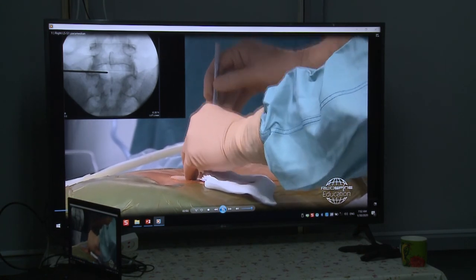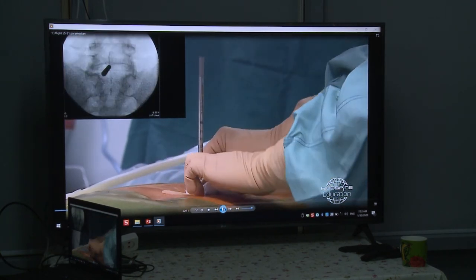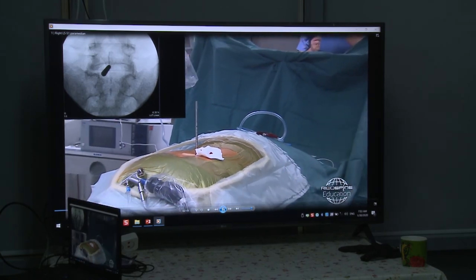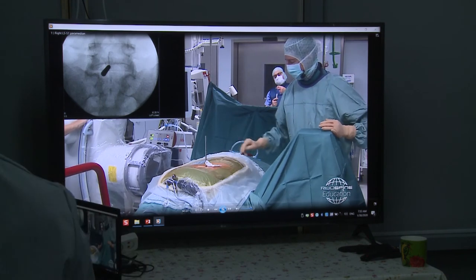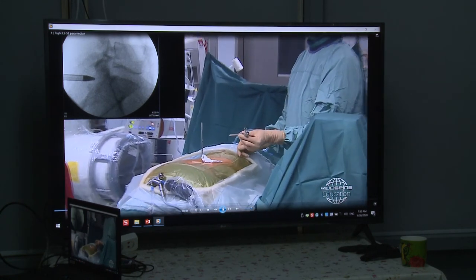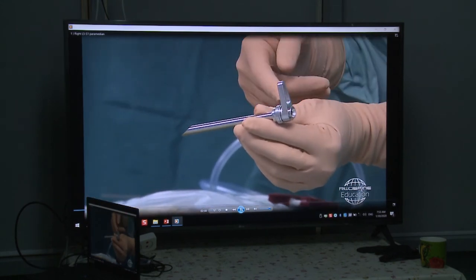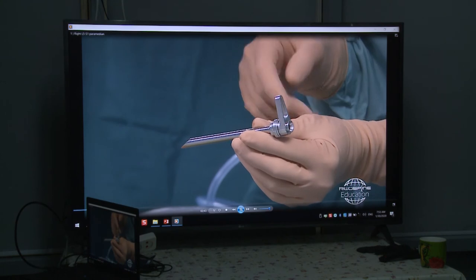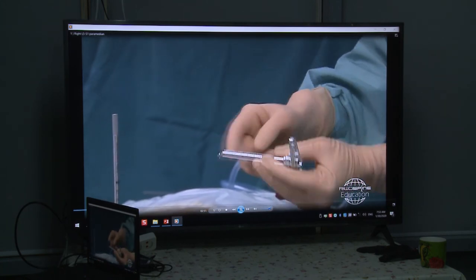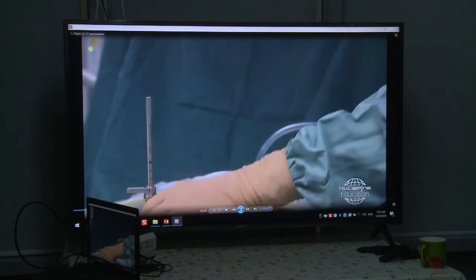Then we put in the dilator, and I feel already on the bone that I touched something. Control in AP view, and see my approach to the interlaminar window. Then we switch to the lateral view. Okay, it's a good position. Then the cannula. Dr. Kong told you for the transforaminal approach that the handle was opposite to the opening. Here in the interlaminar approach, we have the handle on the same side as the opening. That's due to technical conditions, because for holding the endoscope we need this hand. The opening is to the medial aspect, that means to the flavum ligament. So then the approach is done.